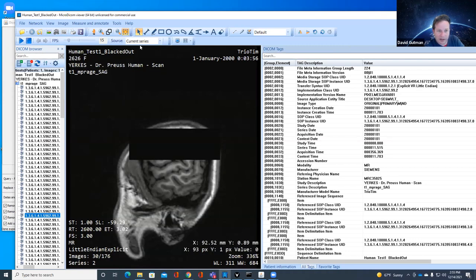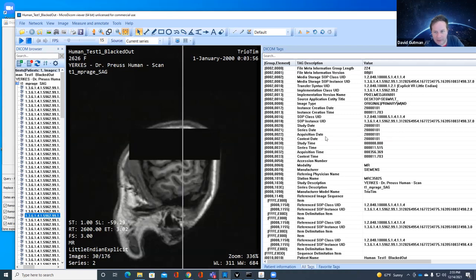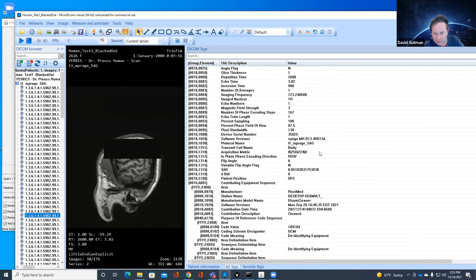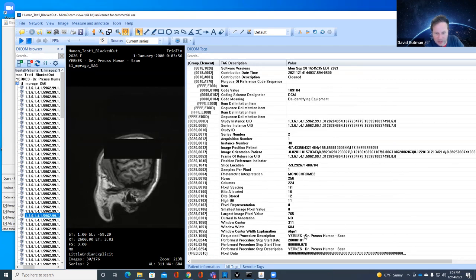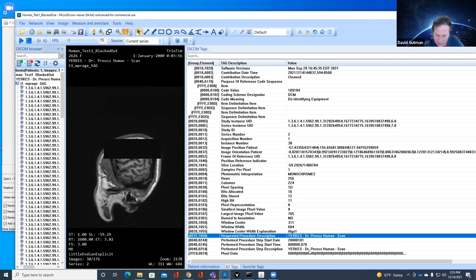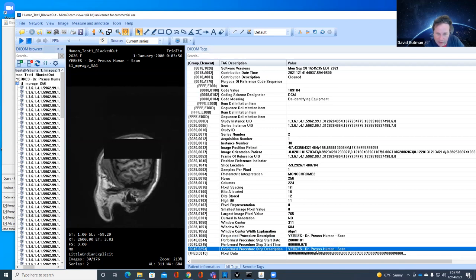It looks like I didn't click the right button to get rid of the scan name. Going through the DICOM data, there's a 'requested procedure description' tag that I'm not sure if the DICOM Cleaner should have removed and didn't, or if this is just some random tag that was added at the scanner that I would have to remove using another process — perhaps because this is primate data handled a bit differently than human scans.